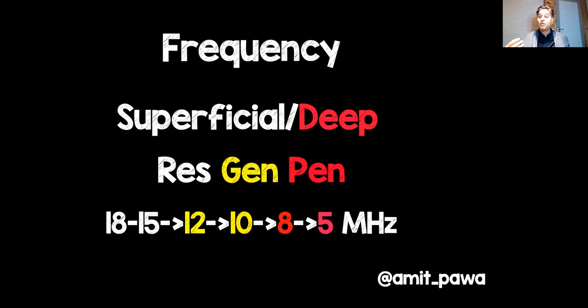So again, when you're thinking about the frequency to use, when you've collected your probe, you're holding it correctly, you've got a lovely image on the screen, you need to think about whether you're scanning something superficial or deep. If you are scanning something deep, use a penetration preset or lower frequency range. If you're looking at something super superficial like an ankle block, use a resolution setting or high frequency range.